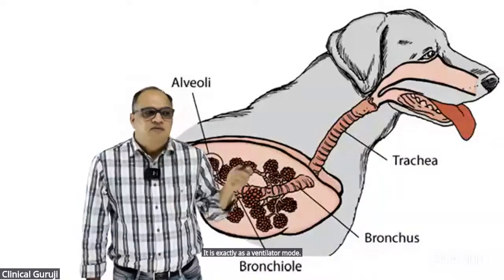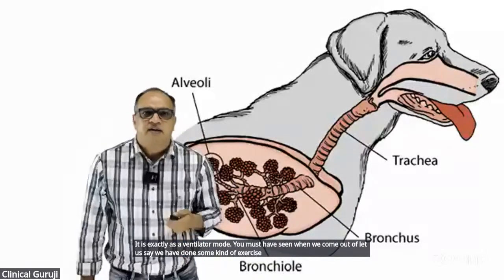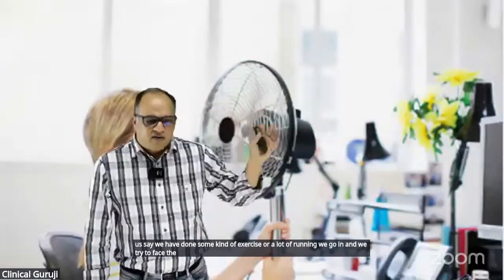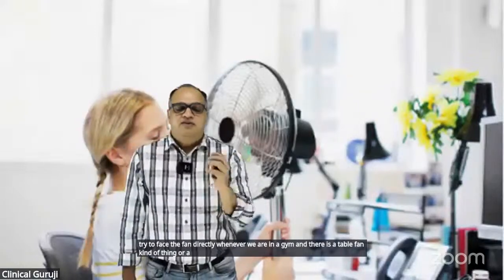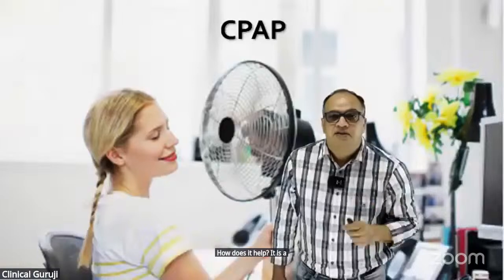You must have seen when we come out of, let's say, some kind of exercise or a lot of running, we go in and we try to face the fan directly. Whenever we are in a gym and there is a table fan or a ceiling fan, we try to go in front of that fan and we try to grab all the air in. What exactly is this fan doing? It is putting a continuous pressure of air on your nostrils. How does it help? It is a continuous positive air pressure.